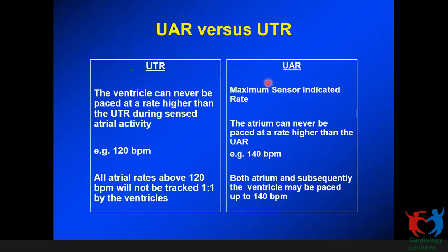And if the patient has pure sinus node dysfunction with intact AV conduction, then the 2:1 block is not a consideration, because the AV node is going to be conducting in that case. But it becomes a confusion sometimes when the patient has both sinus node dysfunction and AV block, or intermittently both of them. So that is when you need to keep these two in mind.